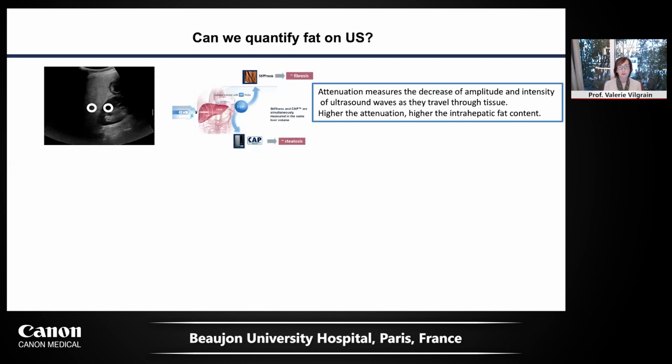And thanks again to the CAP technique, which showed that by looking at the attenuation measurements, we were able to observe nice correlations with the intrahepatic fat content. In other words, the higher the attenuation of the ultrasound wave, the higher the intrahepatic fat content.